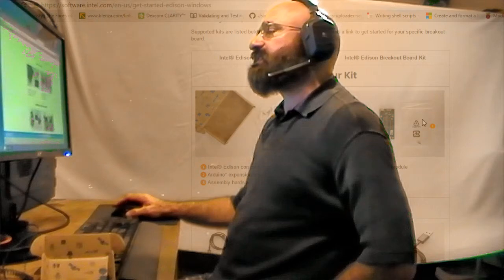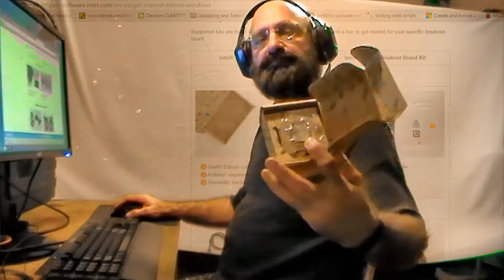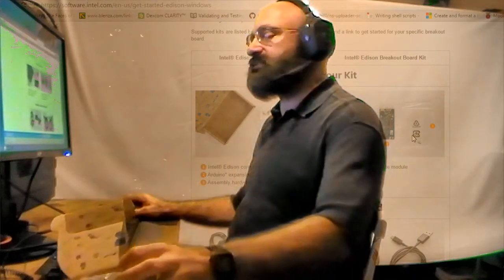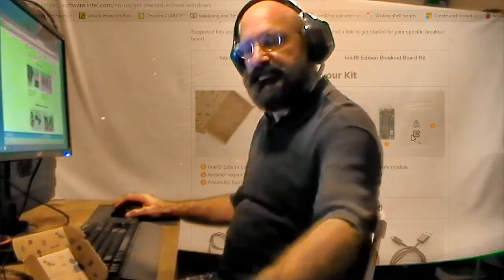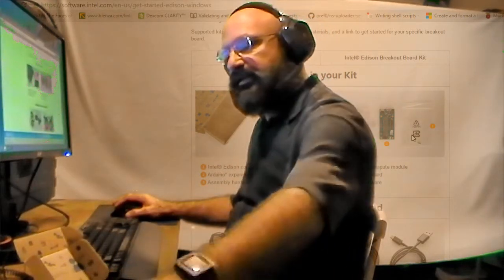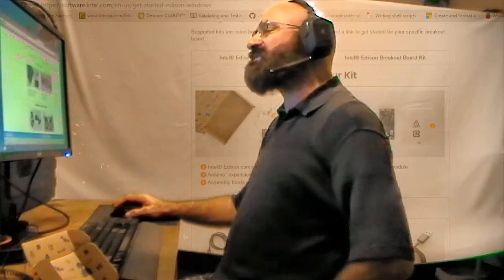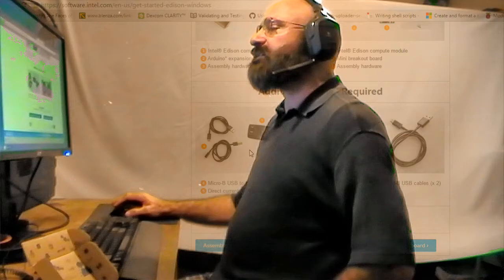Here's the parts in your kit. Now I have this part right here. This is called the Edison with the mini breakout. That's exactly what this is. This is the mini breakout, and then this is the Edison. And we're going to use the Edison and not the mini breakout. We're going to use the Explorer, which is very similar to this. And then these are the cables that we need.